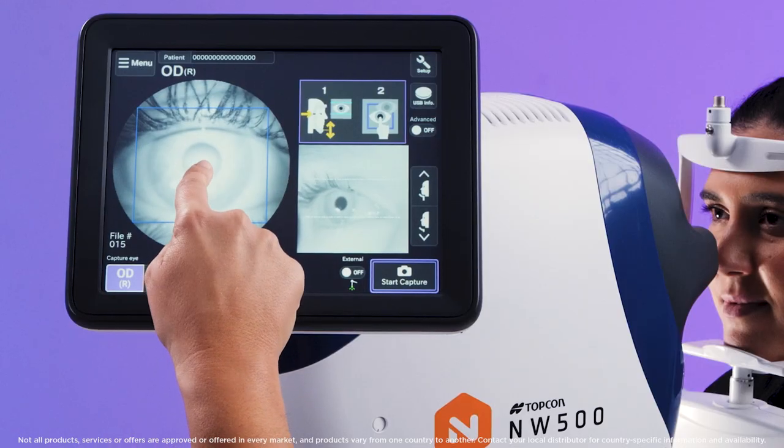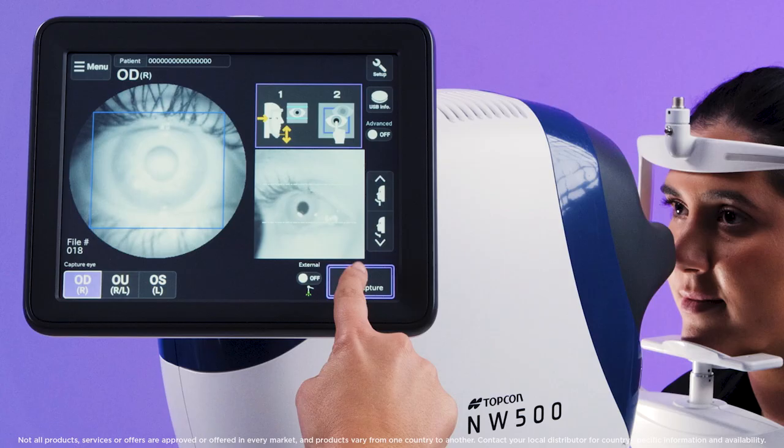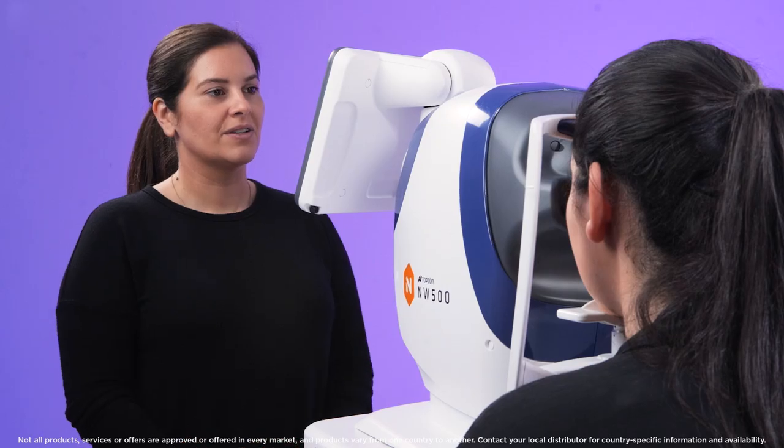Touch the centre of the pupil on the monitor to centre the instrument. Then press the start capture button to begin the capture process. The instrument automatically enters manual capture mode.